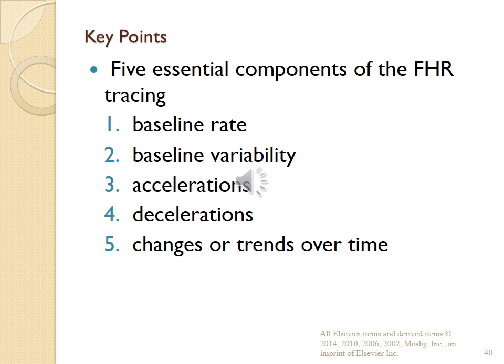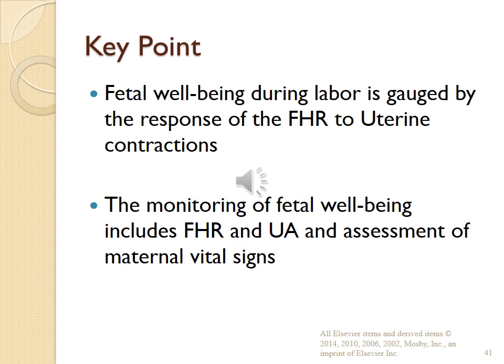5 essential components of the fetal heart rate tracing: baseline rate, baseline variability, accelerations, decelerations, changes or trends over time. Key points. Fetal well-being during labor is gauged by the response of the fetal heart rate to uterine contractions. The monitoring of fetal well-being includes fetal heart rate and uterine assessment and assessment of the maternal vital signs.